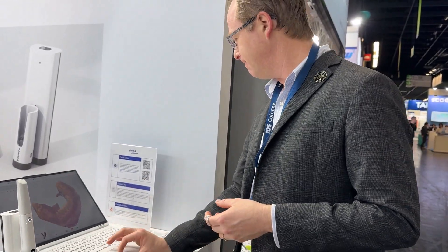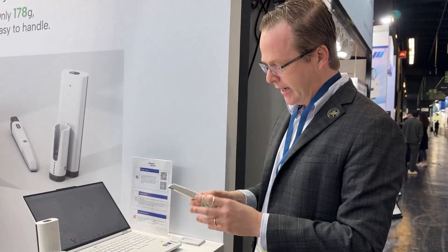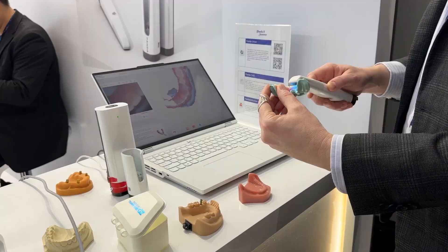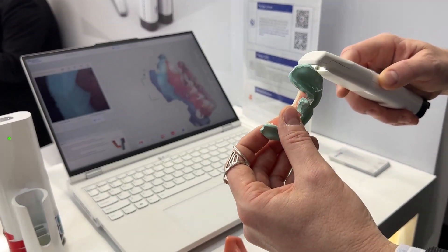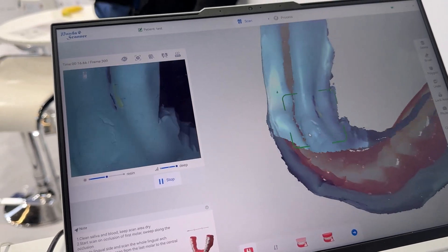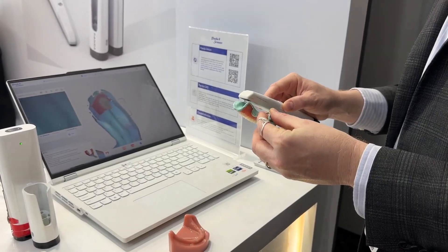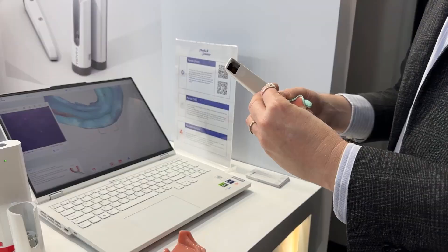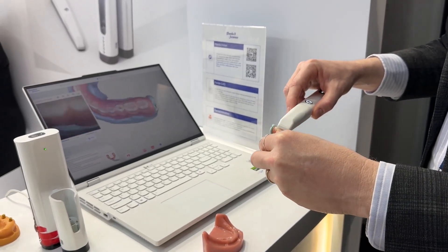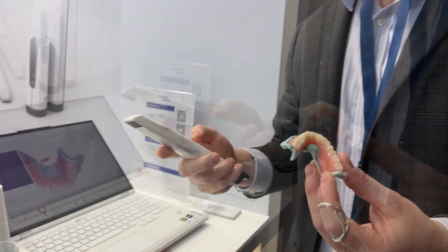Let's go ahead and try it with a denture as well. This is my relined Zest Locator denture. I'll pick it up and just start scanning here on the teeth. Awesome.